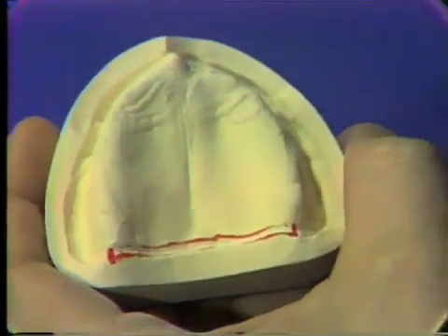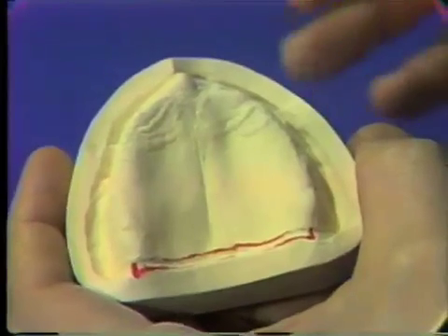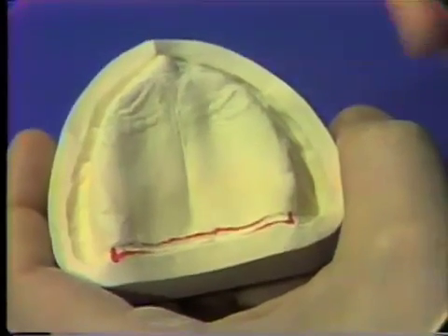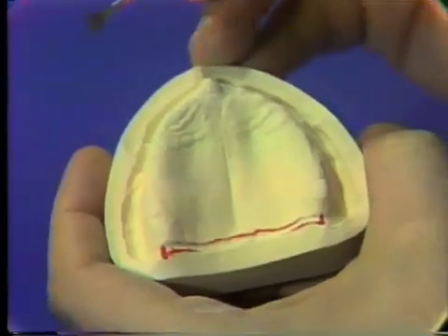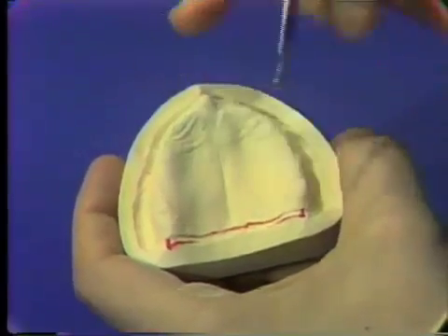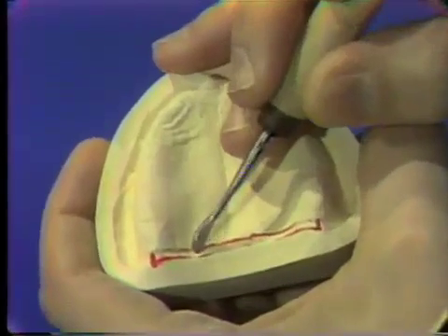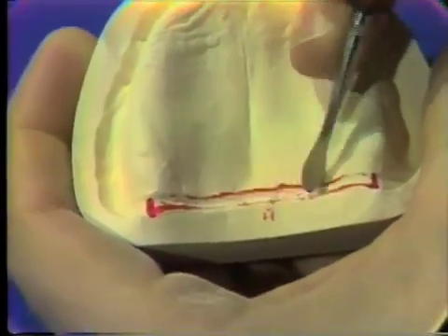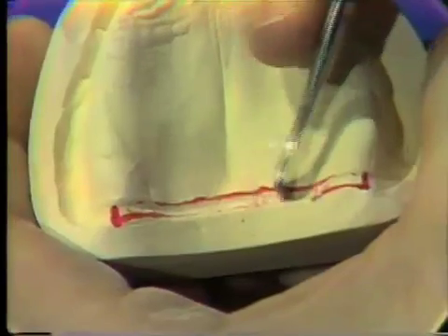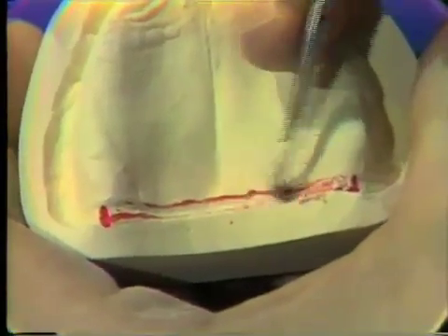That line depth is approximately one half the depth of the number eight round burr. We can then either use a vulcanite scraper or the round end of a number seven wax spatula and blend or round off the edges of this scribed line, from the scribed line to the posterior area and also from the scribed line to the anterior limit of our post dam.